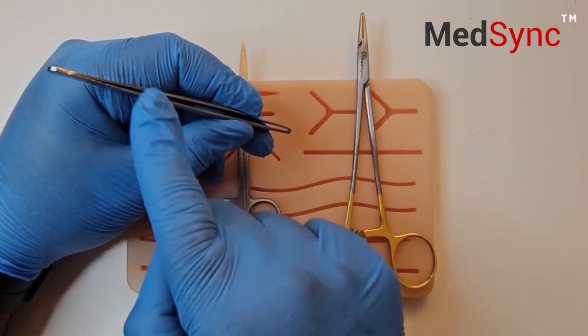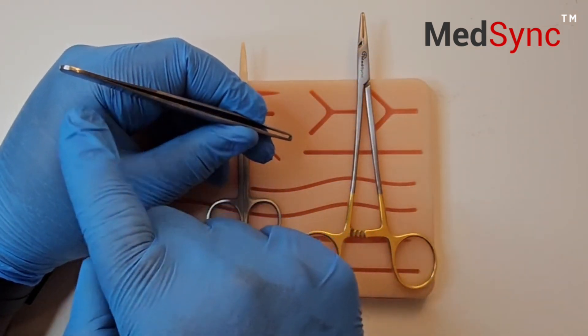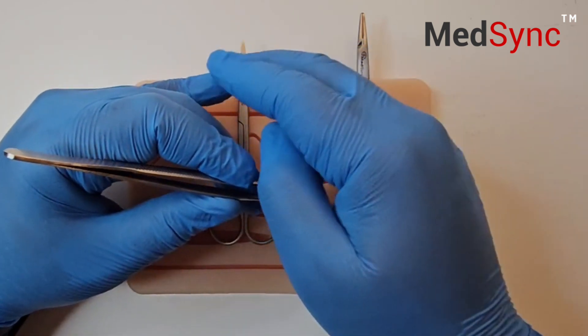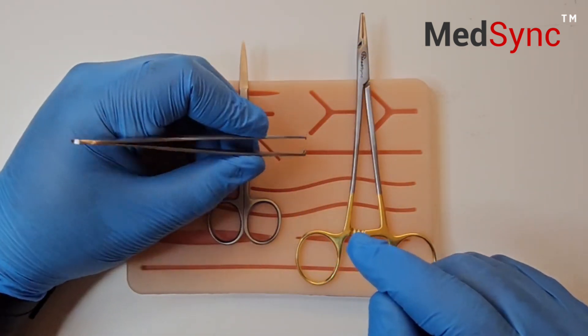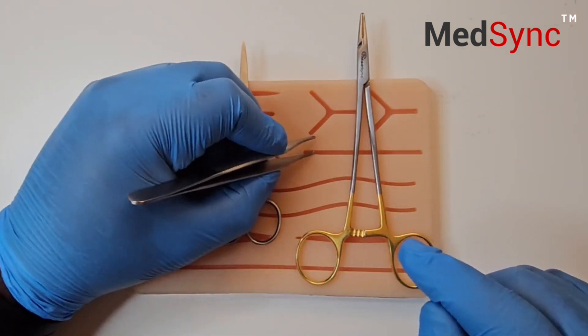Try like this with the body of the forceps above your index finger. Little finger can be used for stability and you simply lift up the skin edge.